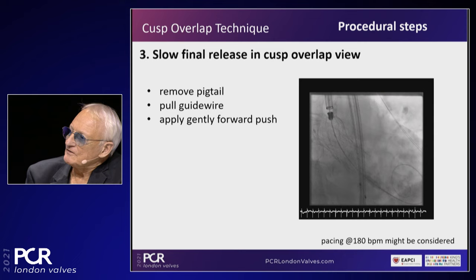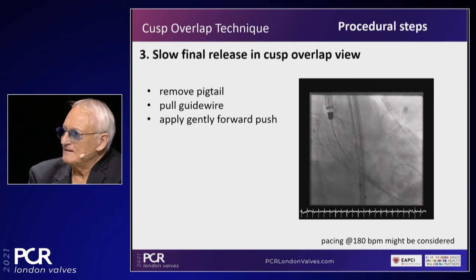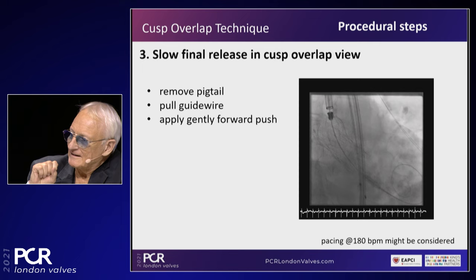But if I may ask Tanya and Nicolas, what I do see is people concentrate on the overlap technique, on projection only, but they still follow the old rule: get into the ventricle, pull back, and then you lose the advantage. It's not only a question of projection; you come from above, don't get into the ventricle and pull back. Let the device come down. You said it, let the device come down, because if you get into the ventricle, you lose the advantage of not touching the critical part of the membranous septum. So I think it's important to mention not only projection, but also that the deployment technique is a little bit different. Yeah, you're right. The technique has been adapted regarding that.